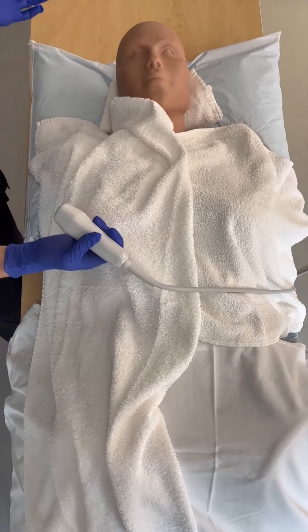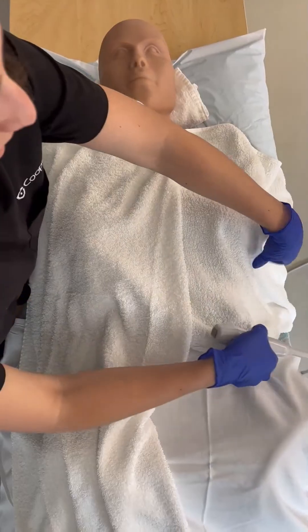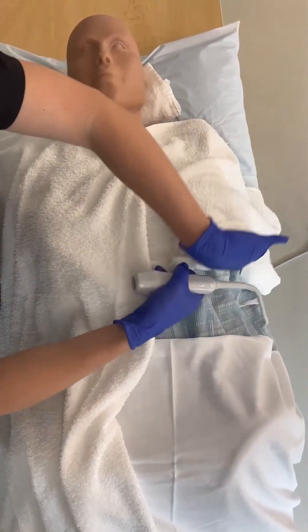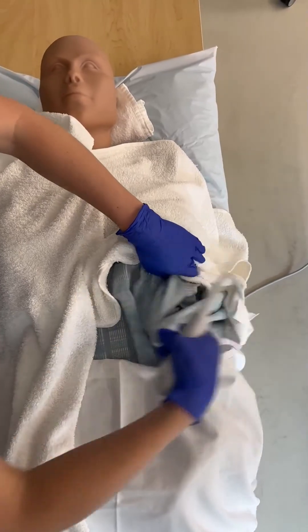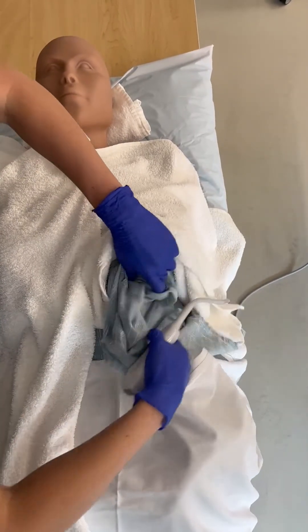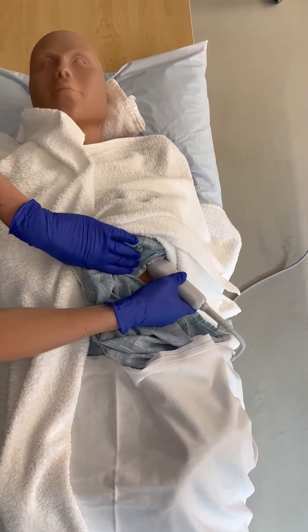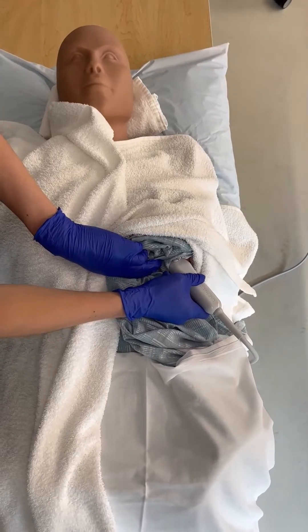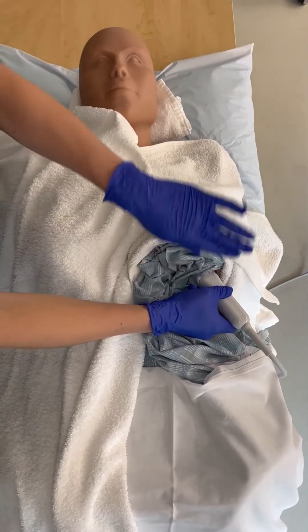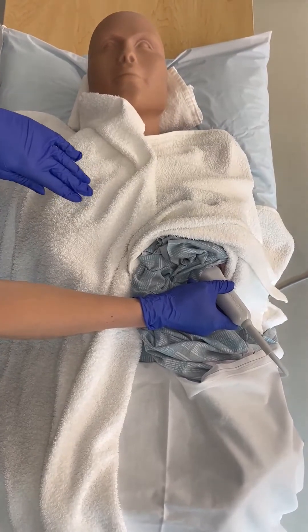At this point I'll usually tell the patient, 'I'm going to lift your breast so that I can put the probe underneath.' Use the hand that you're not holding the probe with to position the towel and the patient's breast appropriately, move the gown from the lateral side, and bring the probe in so that you can see the apical four chamber view. An important part of this is checking that the patient is comfortable after you have their breast tissue and the drapes appropriately positioned.